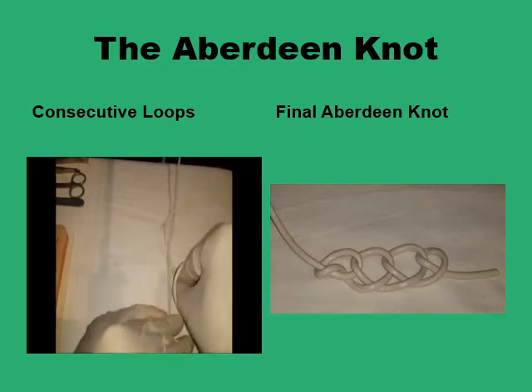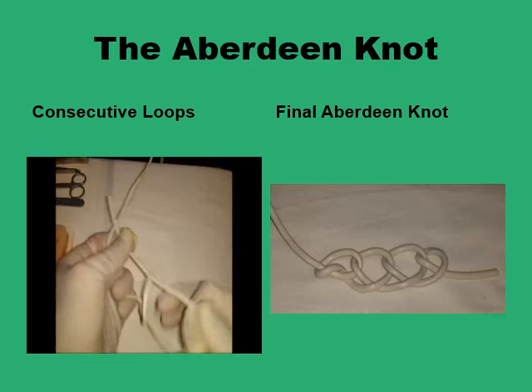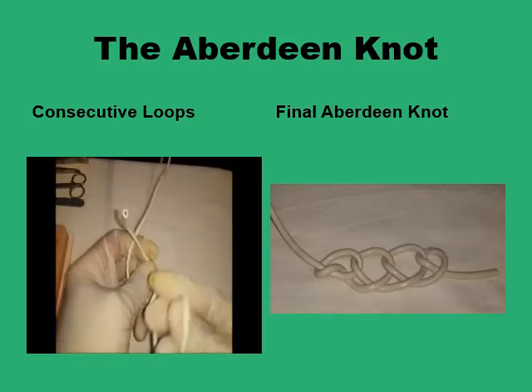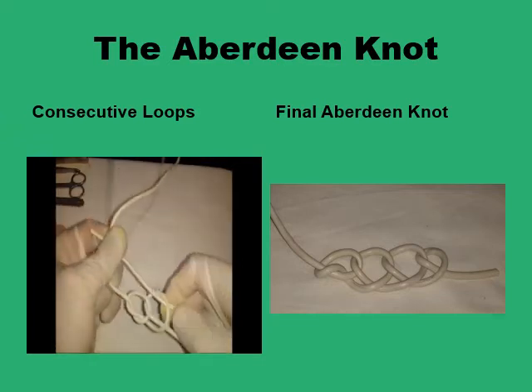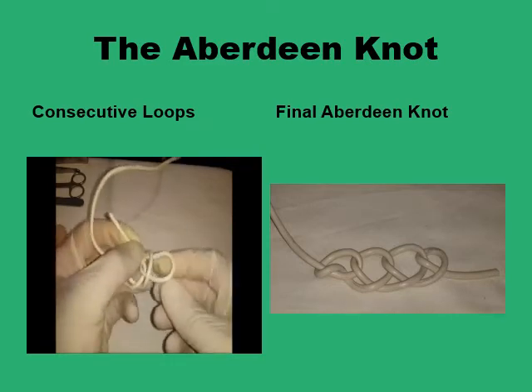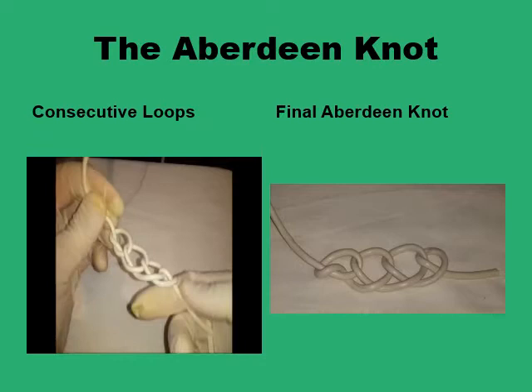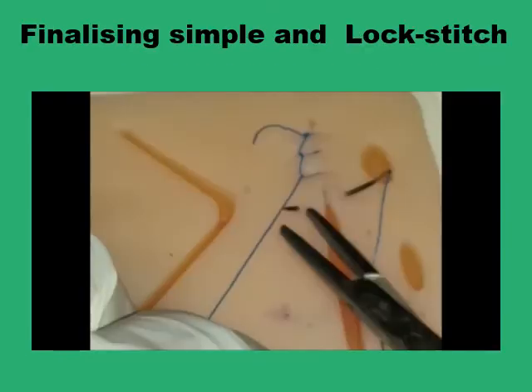The way to do the Aberdeen knot is to do a consecutive looping of the single strand: pull a part of the suture through a loop, form another loop of the same strand, pinch a little bit of the suture line and loop it again so a new loop is formed. You go on doing this until you are happy with the security of your knot, then finish by passing the needle through the last loop, pulling on it, and you've got the secure Aberdeen knot.